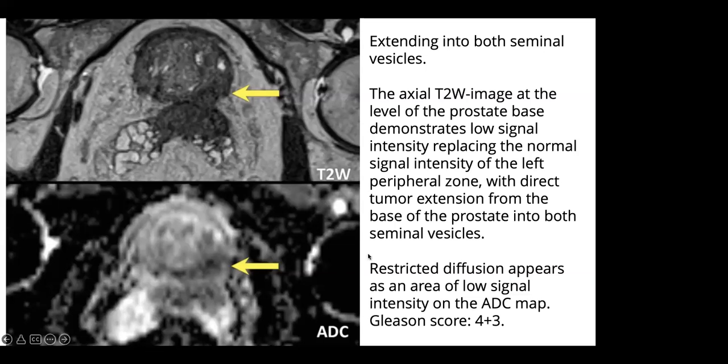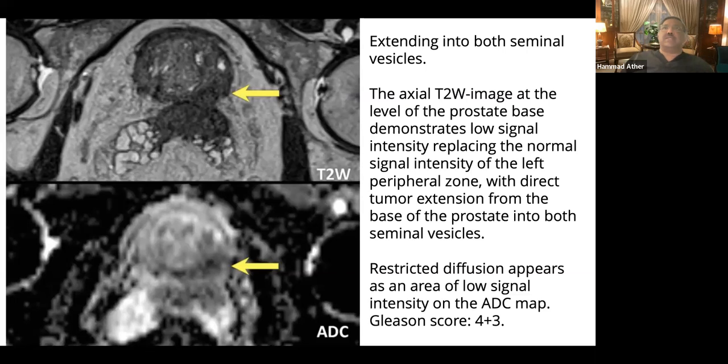Yes, Dr. So, yes, thank you. So this is important because I think I remember at least one case, and this is some years back, where on a poor quality MRI scan, the seminal vesicle invasion was missed. We ended up attempting a radical prostatectomy, and it was extremely badly adherent, and it was really a nightmare surgery.